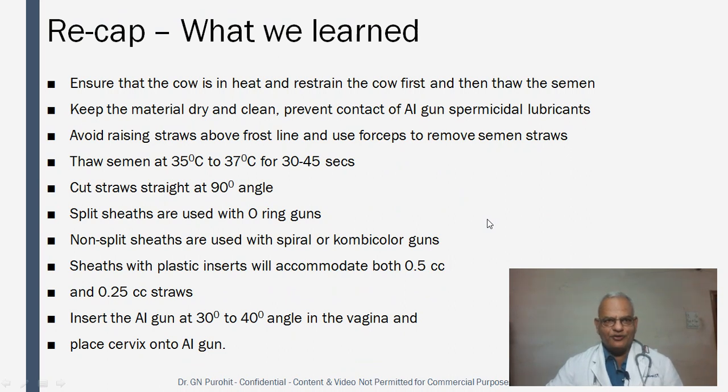To recapitulate: ensure the cow is in heat and restrain her before thawing the semen. Keep all materials dry and clean. Prevent contact of the AI gun with spermicidal lubricants. Avoid raising straws above the frost line; use forceps to remove them. Thaw semen at 35 to 37 degrees centigrade for 30 to 45 seconds. Cut straws straight at a 90-degree angle. Split sheaths are used with O-ring guns; non-split sheaths are used with spiral or combicolor guns. Sheaths with plastic inserts accommodate both 0.5 cc and 0.25 cc straws. Insert the gun at a 30 to 40-degree angle in the vagina and place the cervix onto the AI gun.